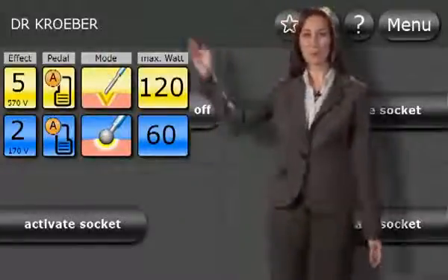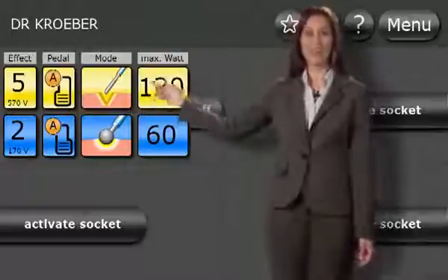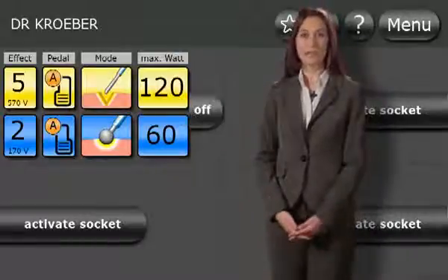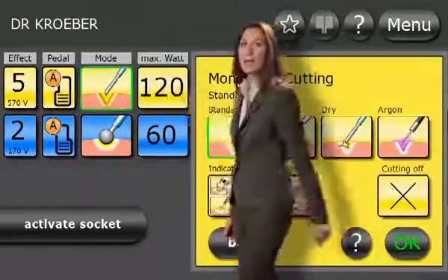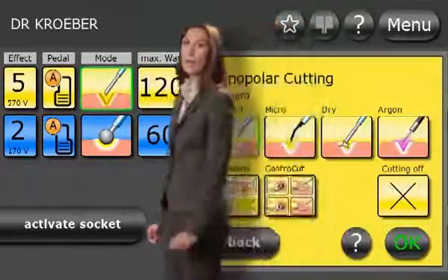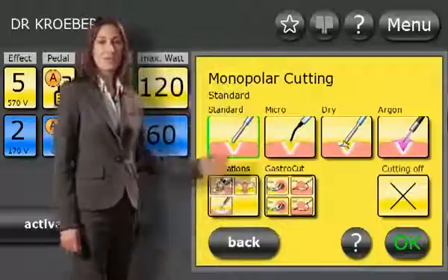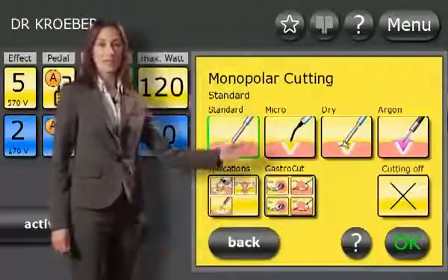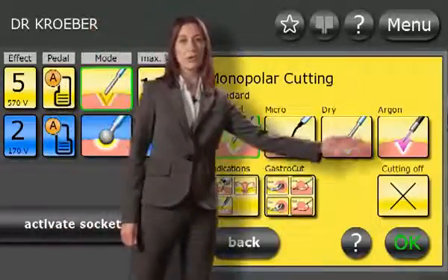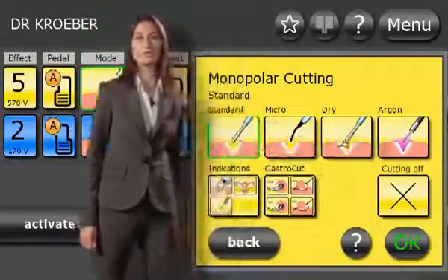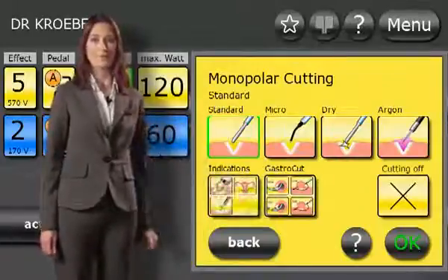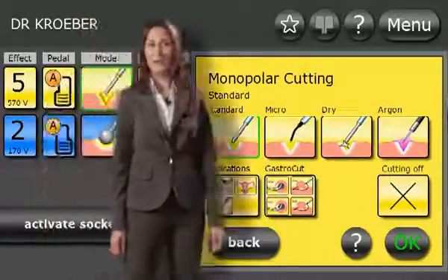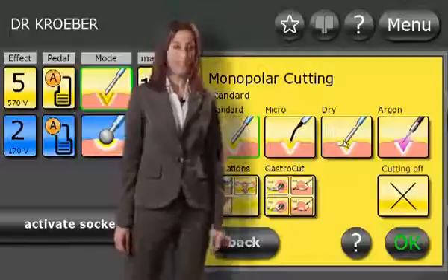Now I would like to show you how to select the mode. A number of different modes are available for cutting or coagulation. For example, the modes available for monopolar cutting are Standard, Micro, Dry, and Indication Specific Modes. Confirm your selection by touching OK.